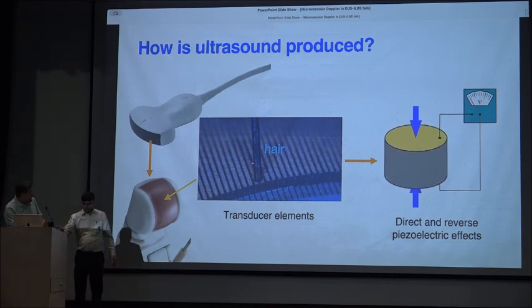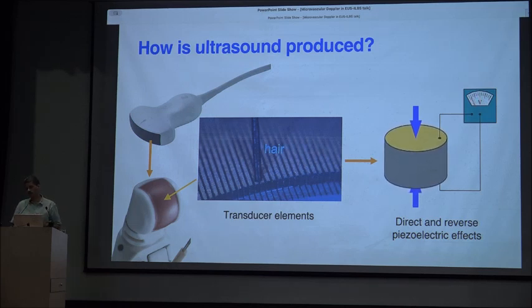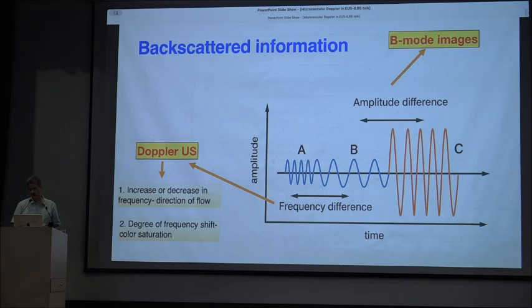And each of these piezoelectric crystals works like this. I will not go into the principles. I don't have the time for the piezoelectric effect and the reverse piezoelectric effect. But it behooves me to say that each of these transducers emits the ultrasound and also acts as the receiver. And we'll see how we need to apply this.